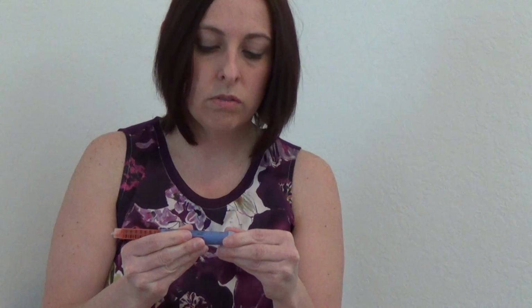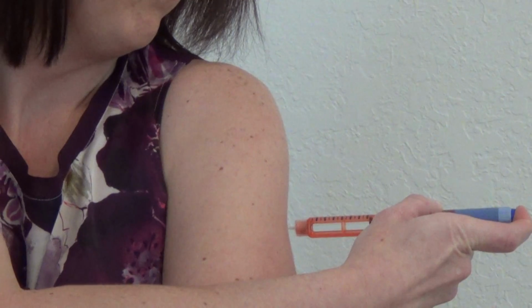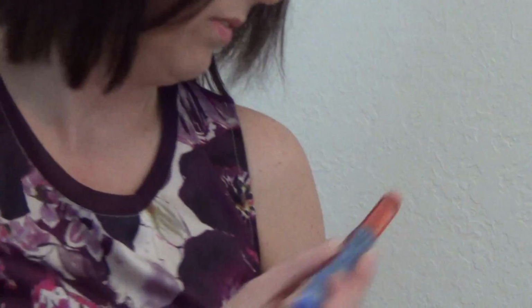You dial up your dose. So if I'm going to inject 10 units, I'll dial it up to 10. And now I'm ready to inject the dose. You want to go in at a 90-degree angle, and you want to push the button in and hold it for 10 seconds. Once you're done, you put the cap back on the needle and you screw it off and discard it in a sharp container. Put the cap back on and store the pen in a safe place.